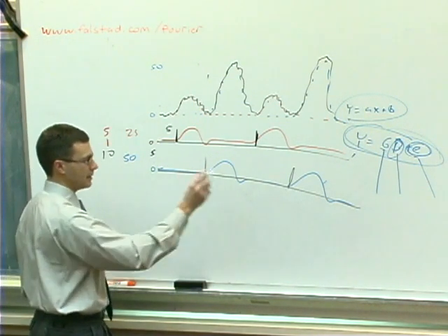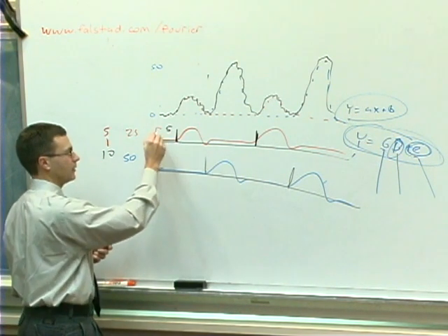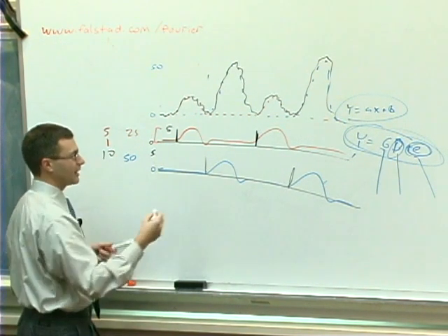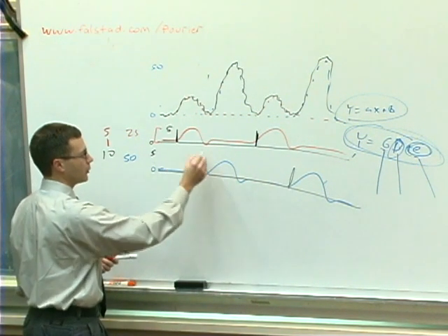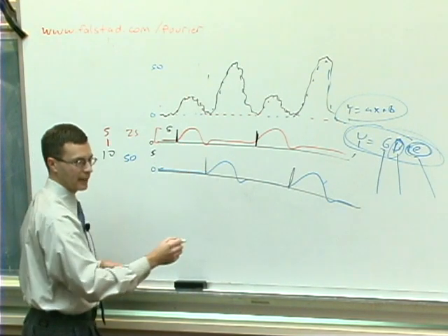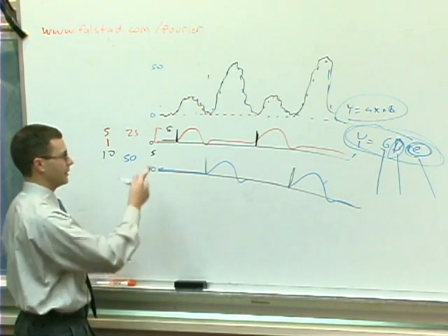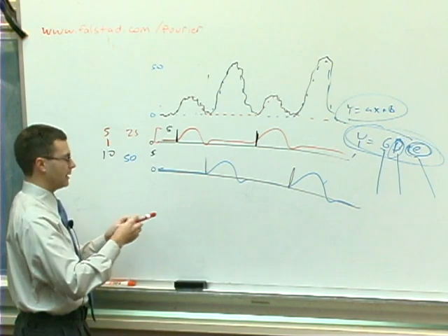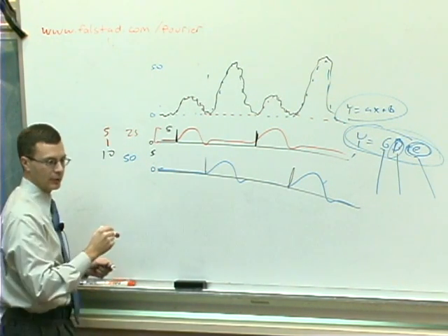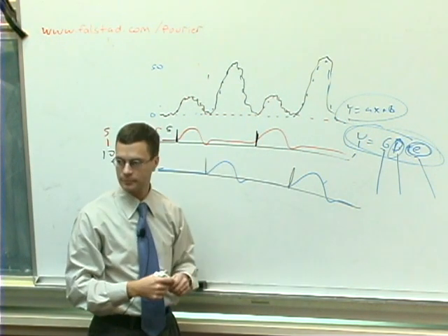Okay? And then the error term, in effect, gets scaled by the magnitude of these things so that the mathematics all work out in the end. But the only thing that's really important, actually, is that both of these curves have the same height. Okay? Both of these vectors are modeling the same size of effect. Because what that allows you to do then is say, OK, what was the difference between the bagel effect and the donut effect? If both of these covariates start off at the same height, differences between those beta values I can then attribute to differences in the size of the effect, differences in the data. Okay?